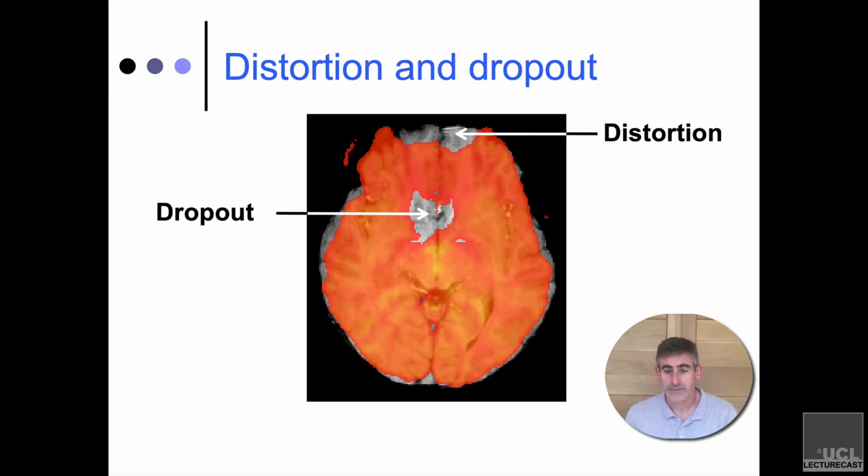It's worth pointing out that one of the advantages of positron emission tomography, or PET scanning, that existed and predated fMRI, is that you don't have that problem. It's not based on magnets, and as a result, you do get equally good signal throughout the whole brain. So there are times when a PET study might be a more effective way of getting at the kind of questions that you want to ask than using fMRI, even though, for the most part, fMRI has supplanted PET as the imaging tool of choice.